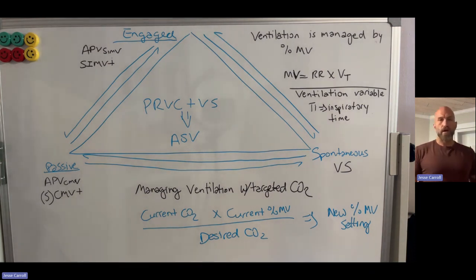So let's talk a little bit deeper about how to decipher the nomenclature and understand what's really going on when you're utilizing ASV with the Hamilton technology vents. More specifically, why ASV can become super valuable in the use of ground and air rescue EMS to simplify mechanical ventilation strategy.